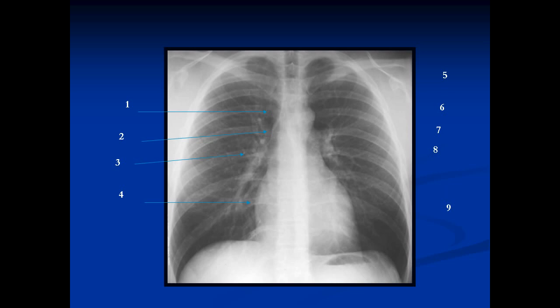We can see the right atrium here — a nice sharp border where it sits. The airway you can see in the midline; it's black. You can see it all the way down to the level of the carina, where it bifurcates into the right and left main bronchi. The little notch here is formed by the aorta, which we can see in relief. The reason we see the aorta so well is because there's air next to mediastinal soft tissue.